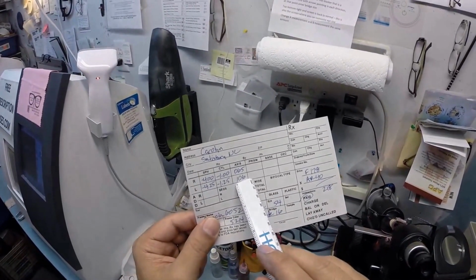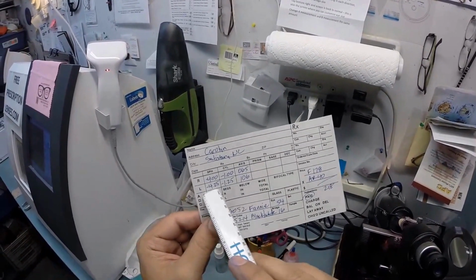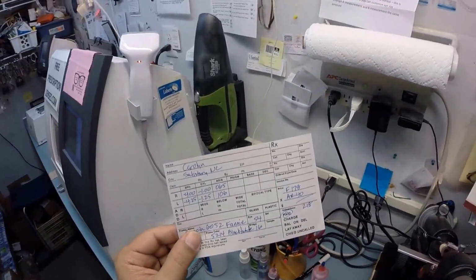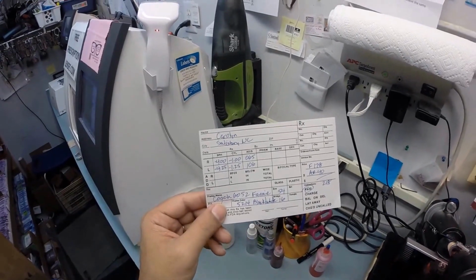Now we're going to turn that fine-tune knob to 106. Now, these first two numbers are real values to be concerned with. The 65 and 106 could be anywhere from 0 to 180 and really don't mean much. In fact, all of this might not mean much to you, but it means something to me.